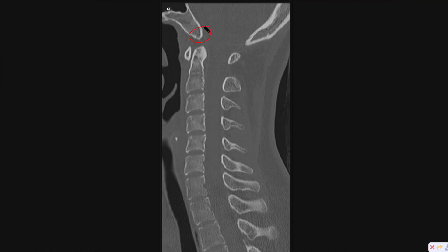This up here is called the basion, and this is the opisthion. There are certain distances we have to keep in mind when looking at these. There's something called Powers ratio, which is the ratio of the distance of the basion to the posterior arch of C1 over the distance of the opisthion to the anterior arch of C1. This ratio should be less than 0.9 — anything wider than that and you have to start worrying about injury to the cranio-cervical articulation.